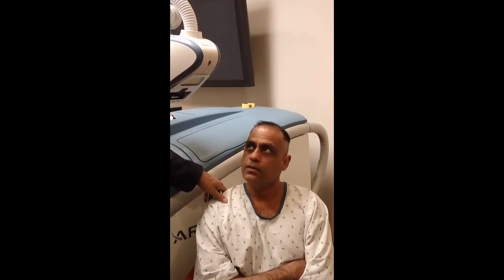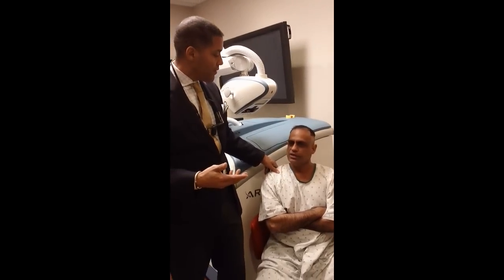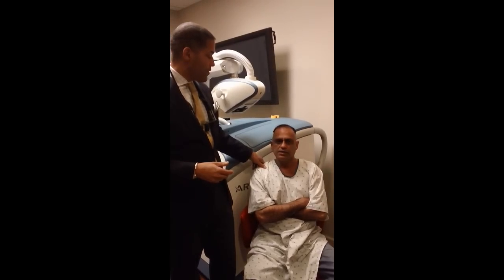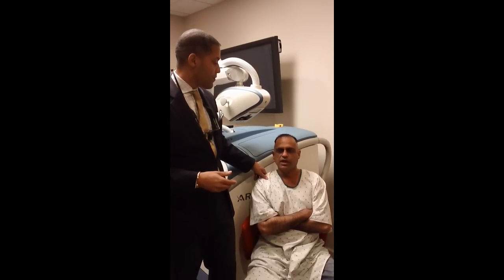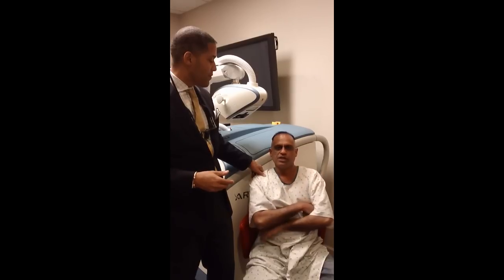So you would say that this was an improvement? A lot of improvement. Were you satisfied with the first procedure? 100%. FUE in general I'm very convinced with that, but with this ARTAS, the robot system, I'm totally convinced and 100% it's a positive result for me. I was afraid before to see the machine, but once I got it I didn't know what it was and then the work was done in very little short time.